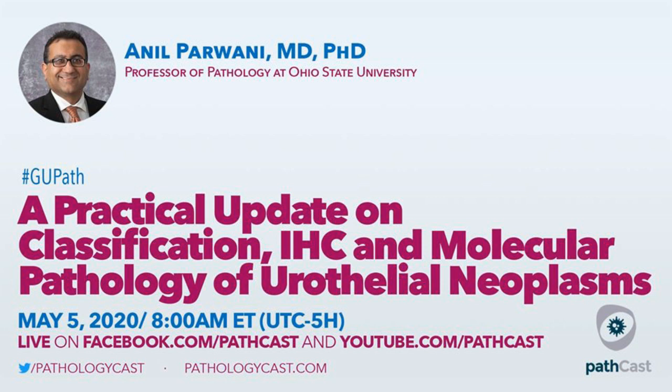So the next question is, in a biopsy, a papillary urothelial neoplasm with focal high-grade features. In this scenario, how to sign out the report and what is its clinical implication? So you have to be very careful, because if you remember what I showed you earlier about the molecular pathways of FGFR3 and RB and p53, if you call something high grade, that has implications for the patient.